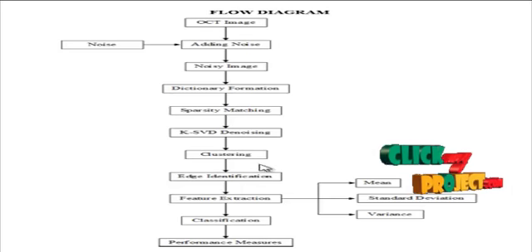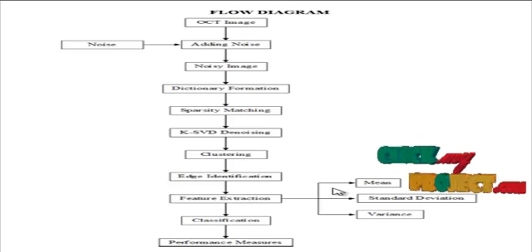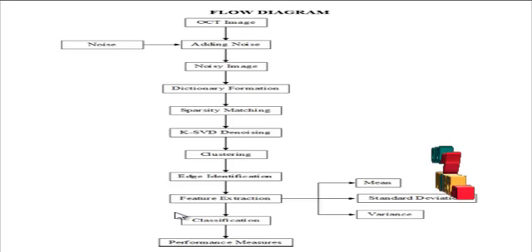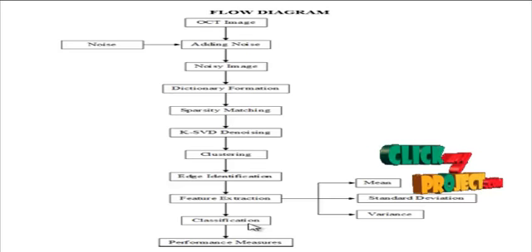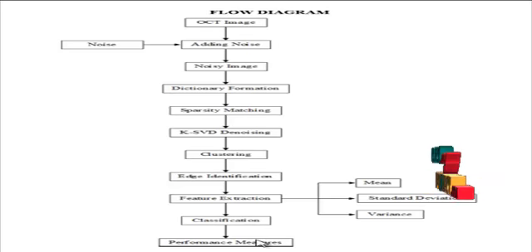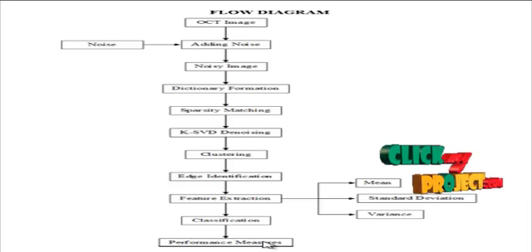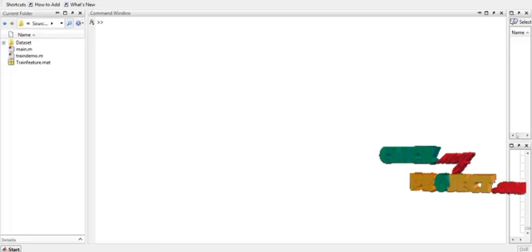The features were extracted from the edge detected regions based on statistical parameters like mean, standard deviation, and variance. The features were then classified in order to identify whether the input image is disease affected or not. And finally, the performance of the process is measured in terms of the PSNR, MSE, and related values. Let me see the running procedure of the process.